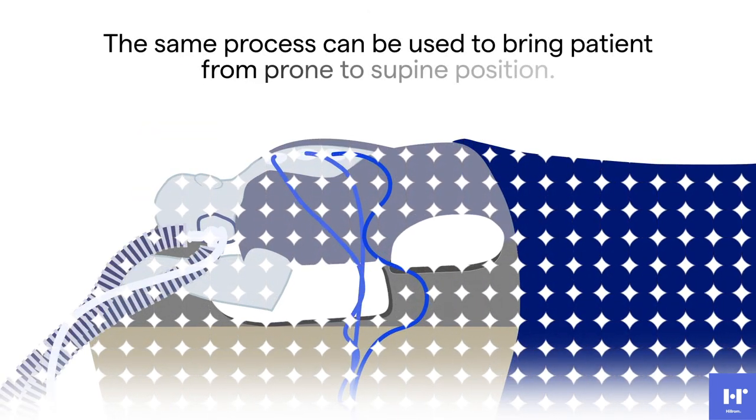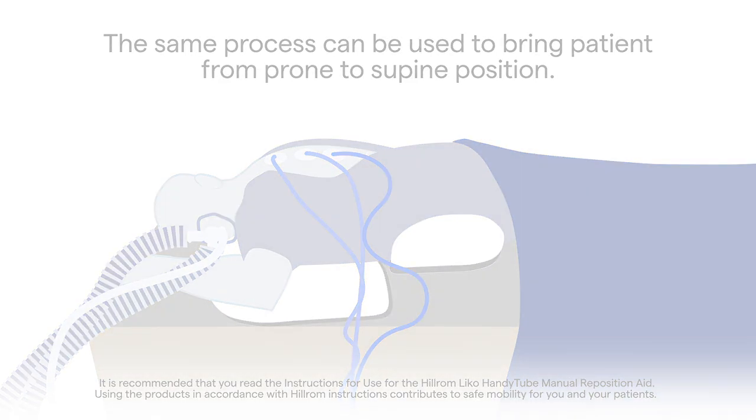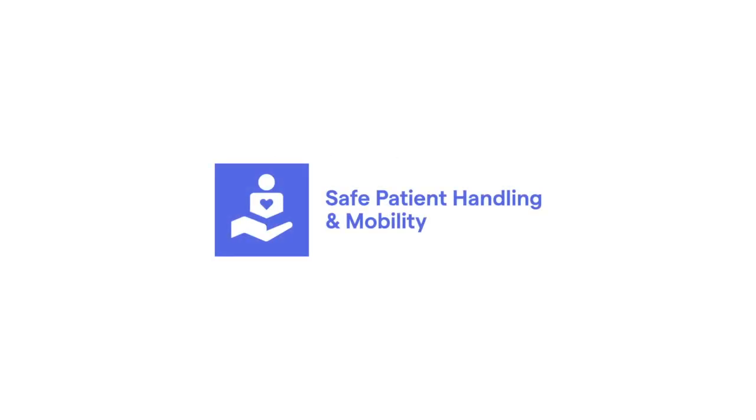The process can be performed in the same manner to return the patient from the prone position to supine. If you have any questions, please visit hillrom.com and select Contact Us for local contact numbers and office locations. Thank you for all that you do to help protect patients by mobilizing earlier and often.